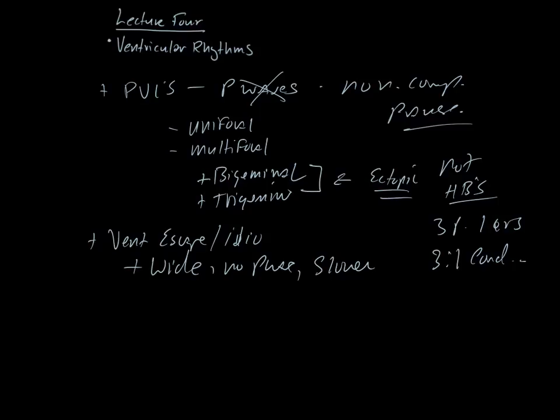So when you're looking at it, you're just going to have to... Junctionals can be wide? Mhm. What if you have a bundle branch block? Yeah. So remember, when you sit down, you've got to go, okay, where does most of the evidence point?